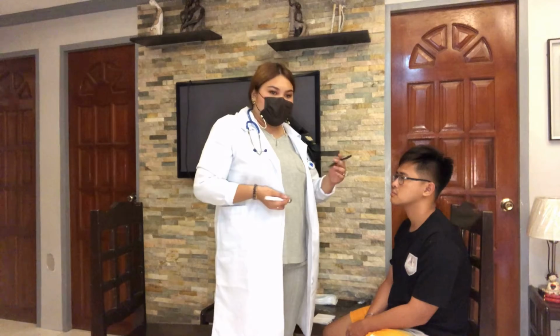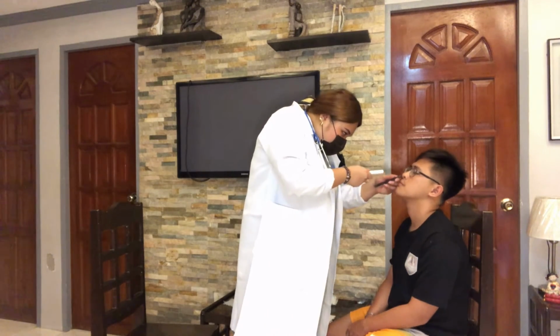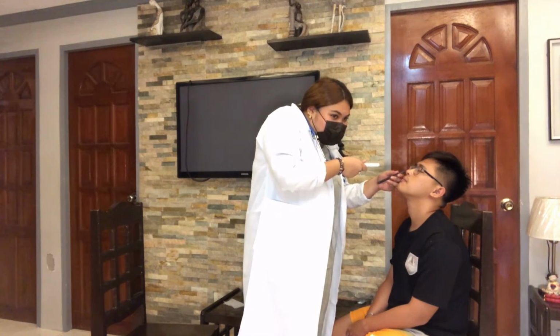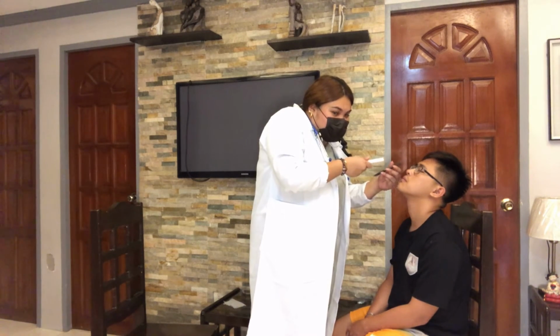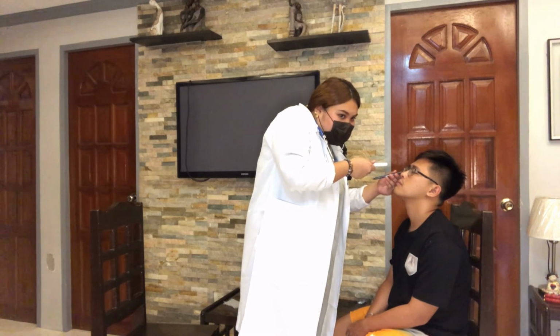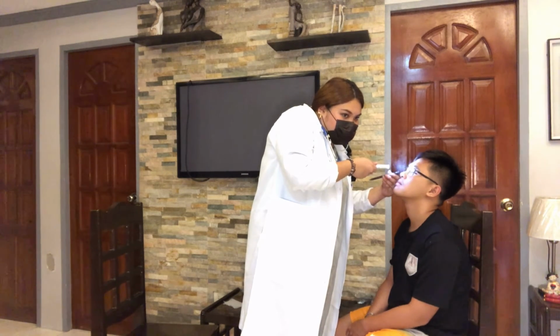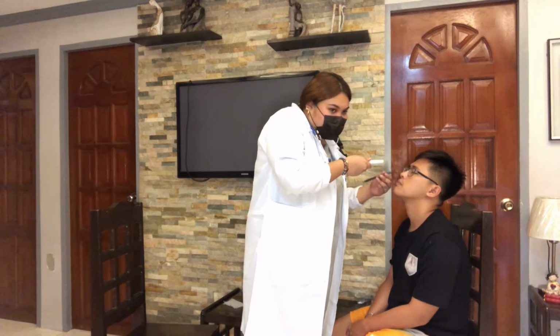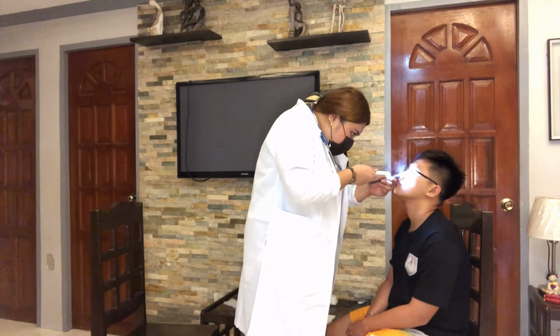Then we're going to be placing now our nasal speculum gently. The nasal speculum should be placed gently to prevent any pressure. And then we will hold the hand position, then hold the light accordingly for guidance and for determining any pressure. Then we will also inspect the integrity of the position of the nasal speculum on each of the nostrils.